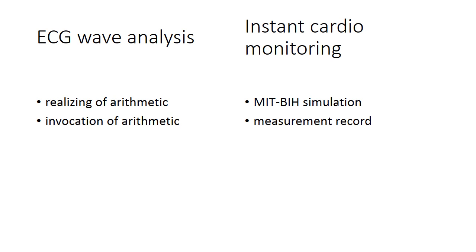Those results include the average rhythm of the heartbeat, the average wave of the QRS wave, the cumulative count of premature ventricular contractions, and the category of arrhythmia.